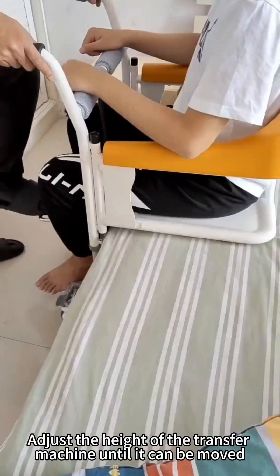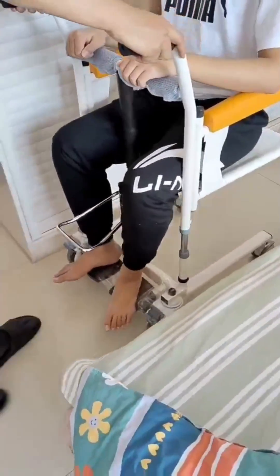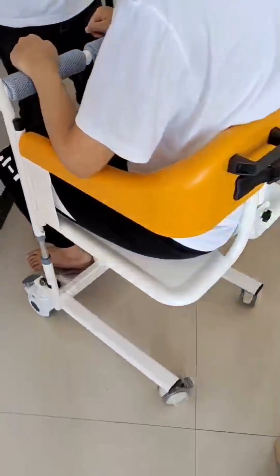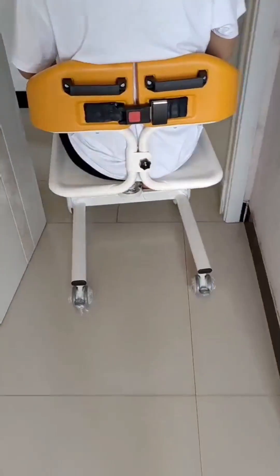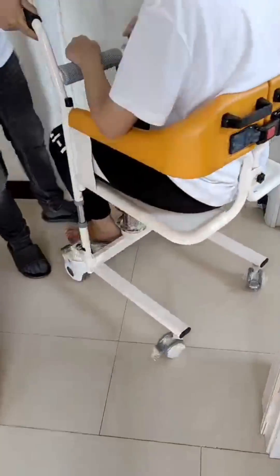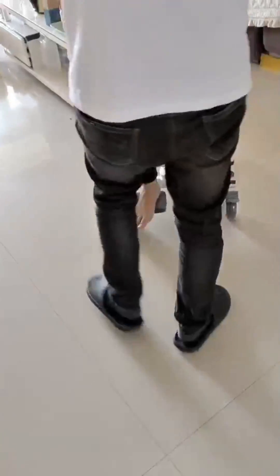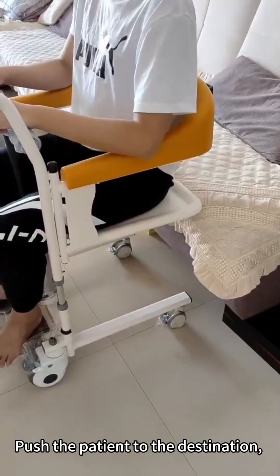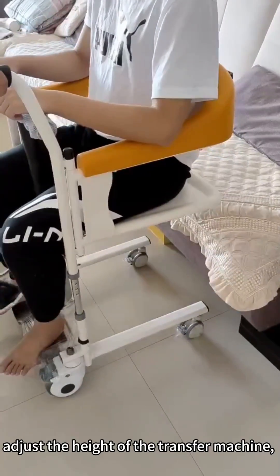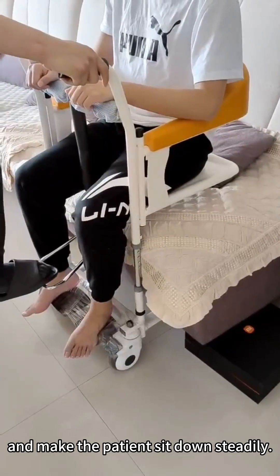Adjust the height of the transfer machine until it can be moved. Push the patient to the destination. Then adjust the height of the transfer machine and make the patient sit down steadily.